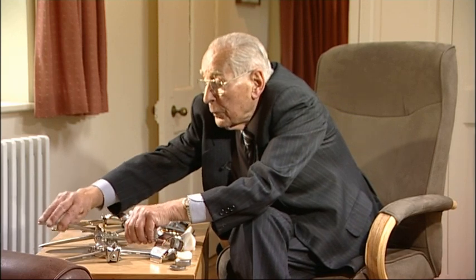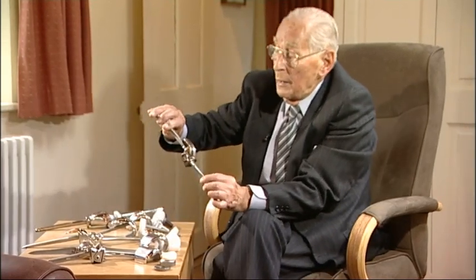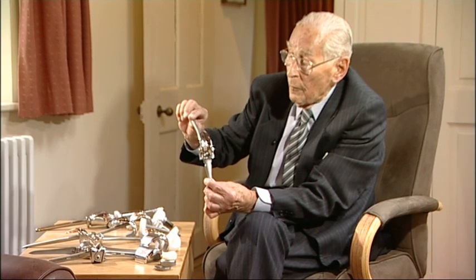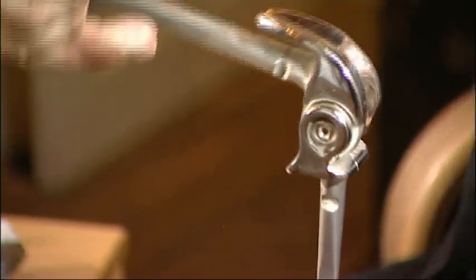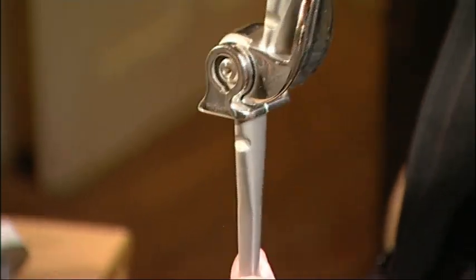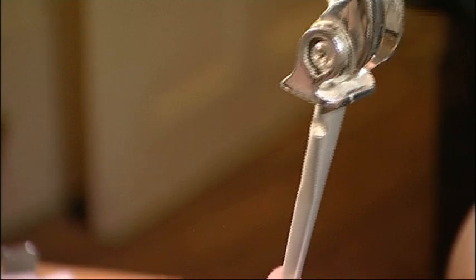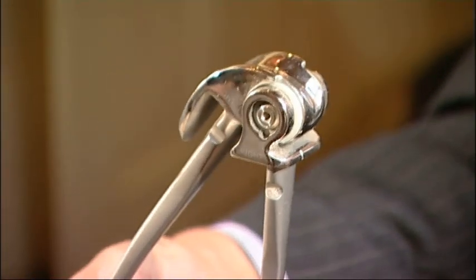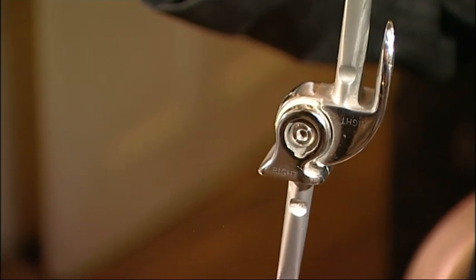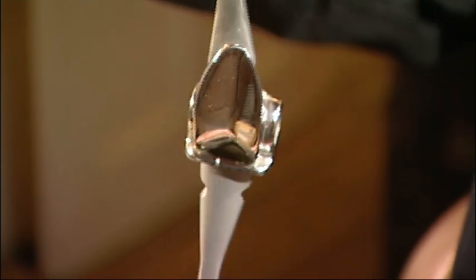The Stanmore prosthesis is a further development of a hinged joint. But here you'll see it has the advantage that it has a valgus offset, and it also has a platform for the patella. In addition, looked at from the side, it has the natural curve of the lower femur.